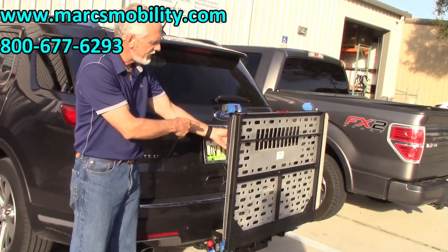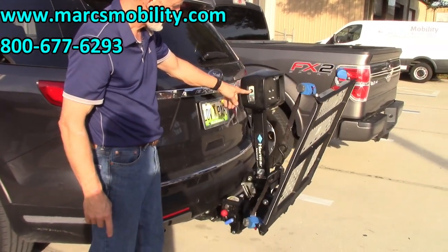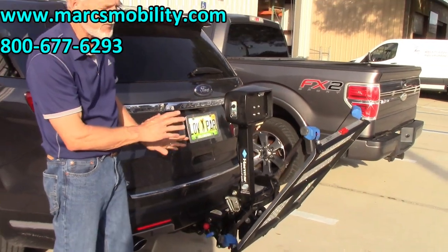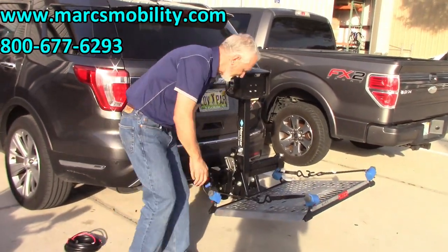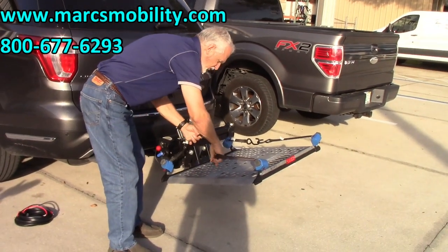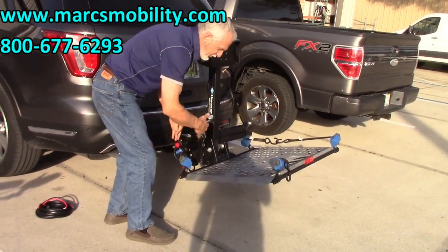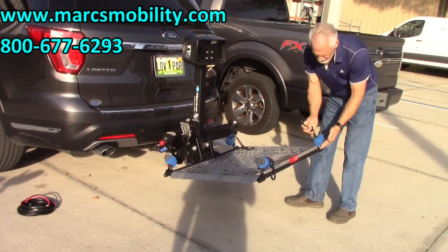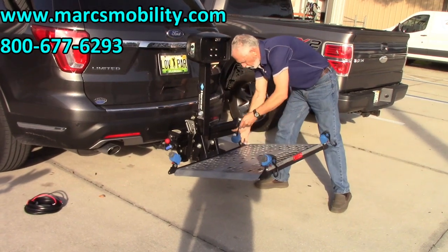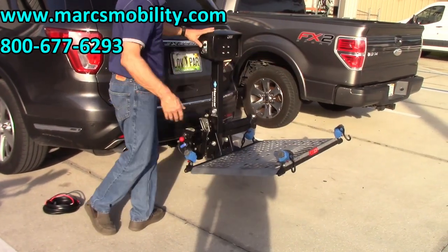To operate: turn the key to the right and push the button down. The noise you hear is perfectly normal. Make sure your straps are outside the platform before you put your chair on here, so you don't roll over the straps with your chair and throw your chair sideways.